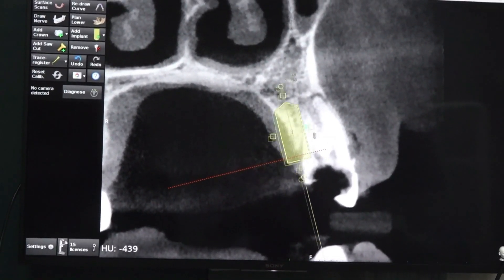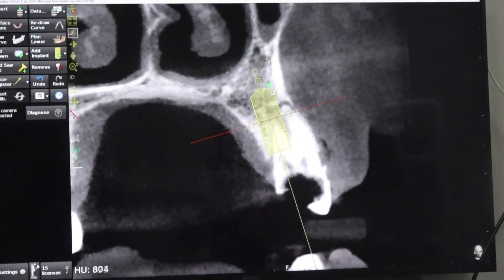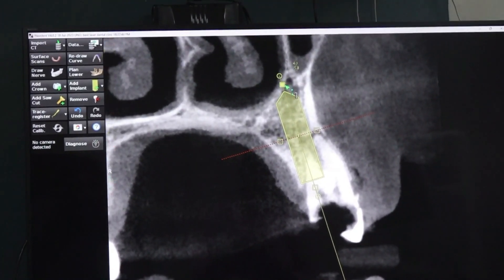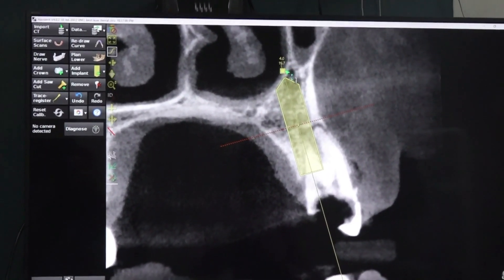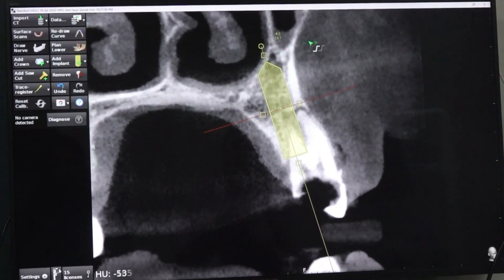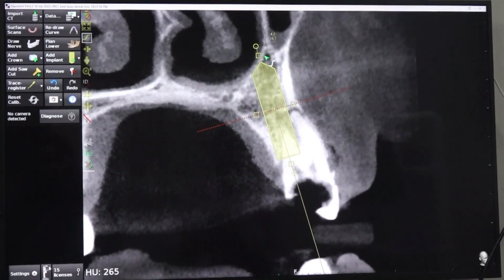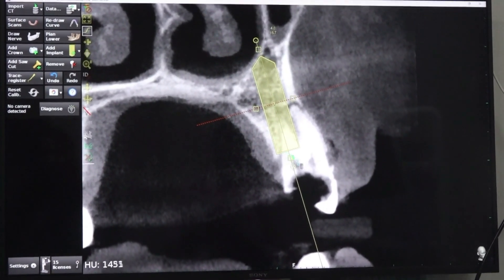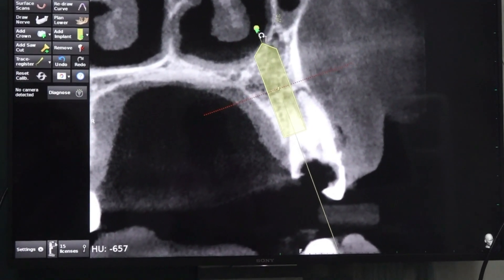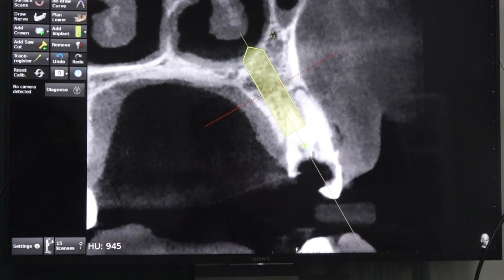There is some rarefaction that we have to take care of. The sinus is very far away and the floor is also very far away. So this is a straightforward situation — along the palatal socket you can go till you reach either the sinus floor or nasal floor, but the probability of hitting the sinus floor will be more because the sinus has not come till the third molar.